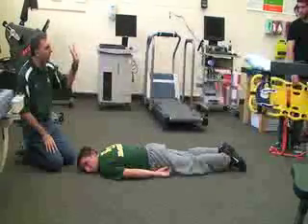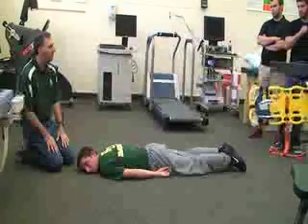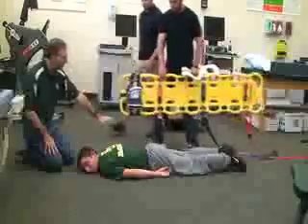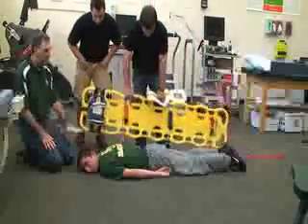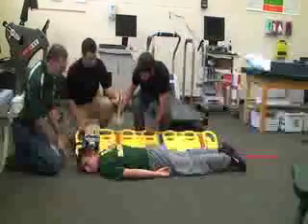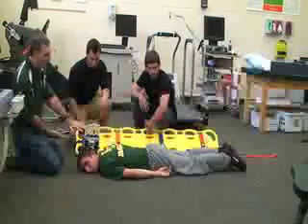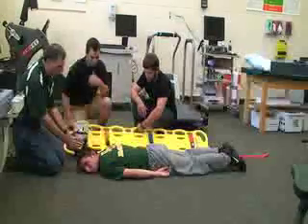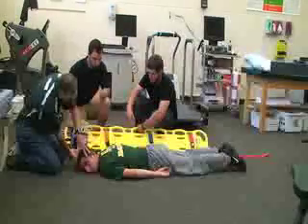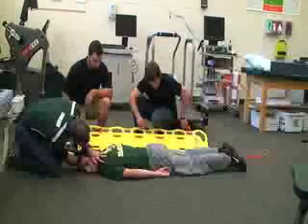Some people might have a signal to call the backboard, or another signal to call EMS. So we have our two rescuers coming out and they're going to be positioning the backboard on the back side of the head. When I get in this position and immobilize, I'm going to have to turn them, so probably the best way is to turn like this — I want to have them in a starting position where I'm supporting both sides of his neck.